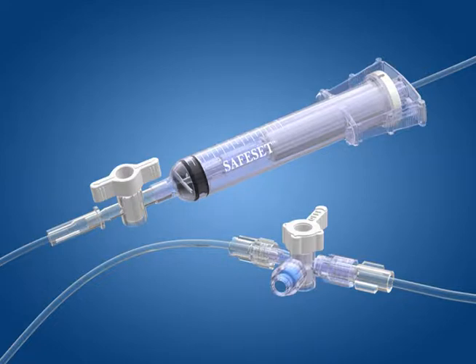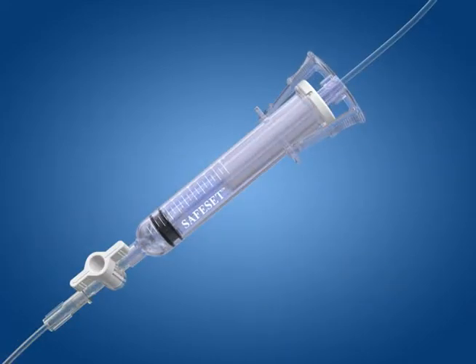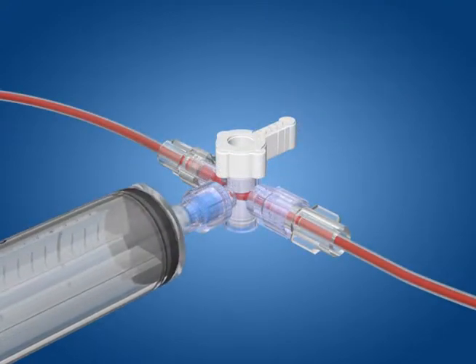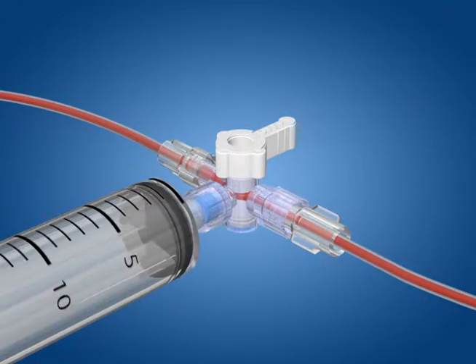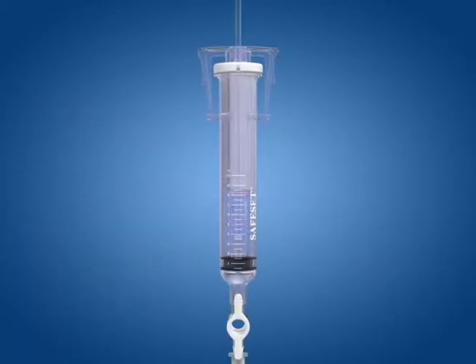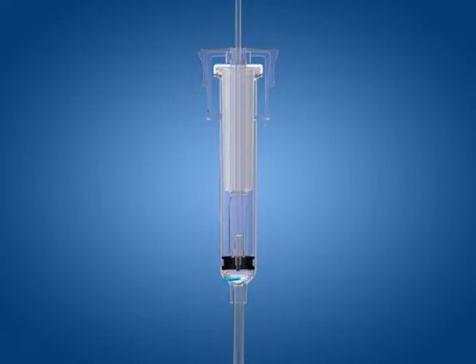SafeSet is ICU Medical's closed, needle-less blood sampling system that allows clinicians access to the patient's blood without exposing it to the outside non-sterile environment or exposing the clinician to blood-borne pathogens. The SafeSet design incorporates an in-line reservoir and novel flushing technology that complements the performance of the TransPAC monitoring systems when frequent blood sampling is required.